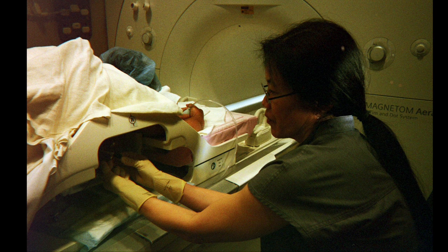The reason that I do that is because you can see these markers much better on mammogram than on MRI.